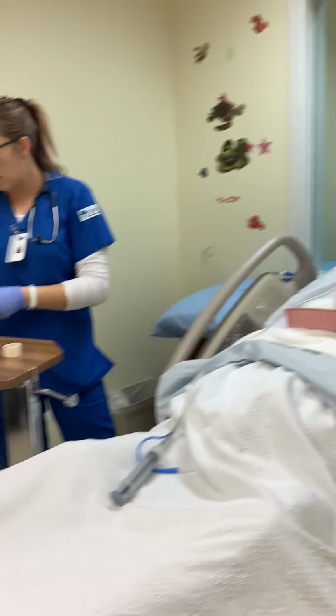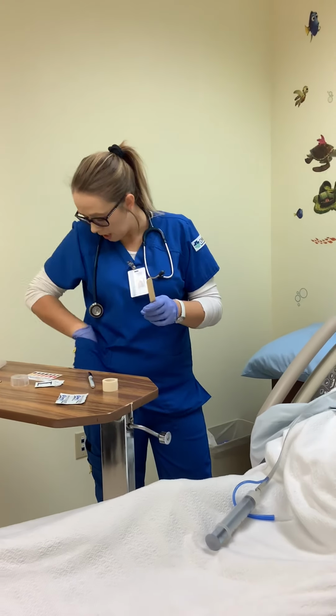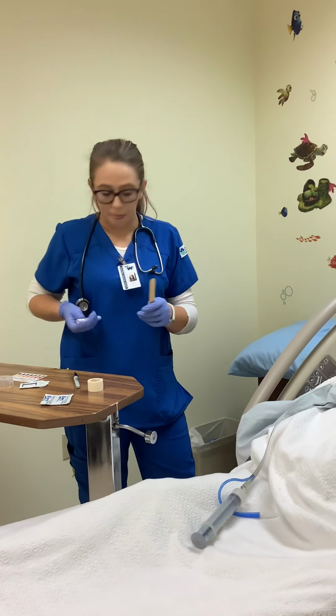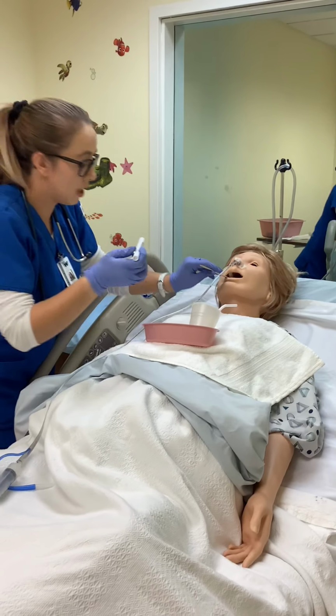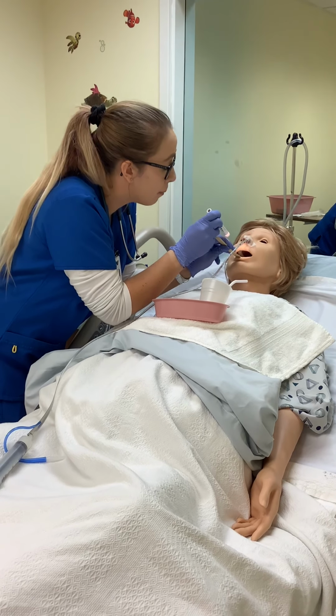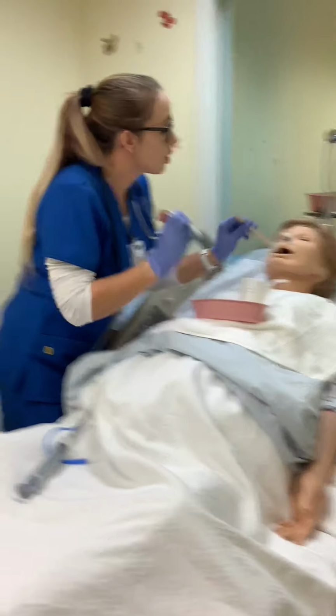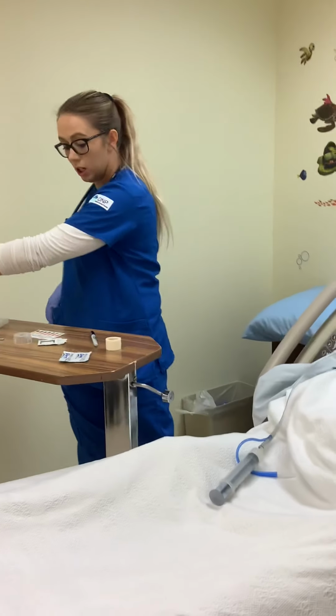Second, I want to take my pen light here and look in her mouth and just make sure that everything looks good, it's going down. X-ray will come in and double check for me, but I just want to make sure everything looks good.